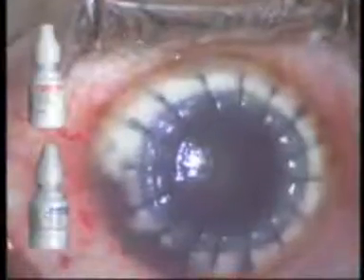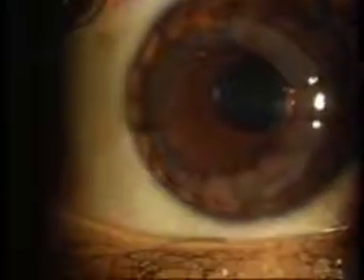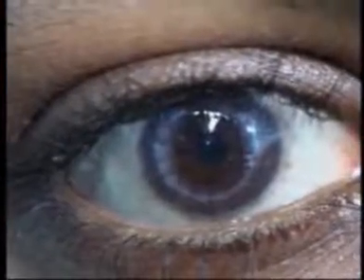Post-operatively, the patients are put on topical steroids and antibiotic drops. Rapid tapering of steroids and topography-guided early suture removal facilitates early visual rehabilitation of these patients with good optical outcomes and minimal adverse events.